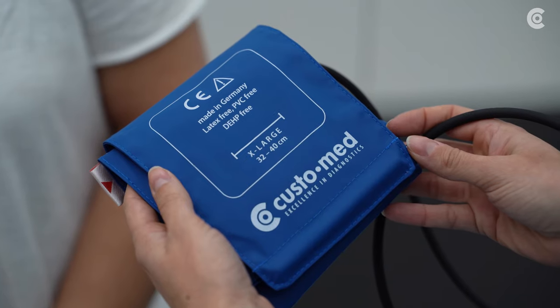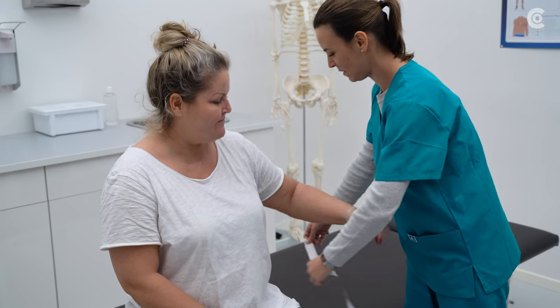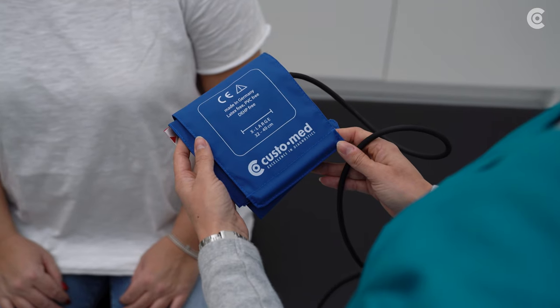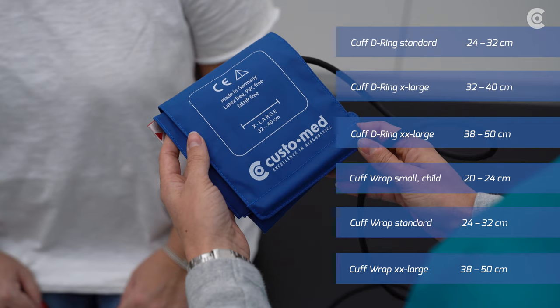Make sure that you use the correct blood pressure cuff size. To this end, measure the patient's upper arm circumference. Cuffs are available in the sizes Small, Standard, X Large, and XX Large.